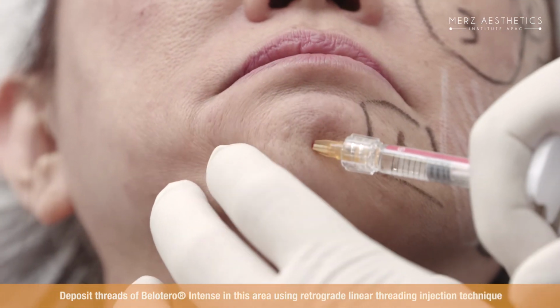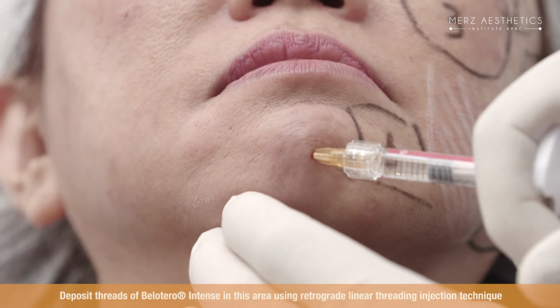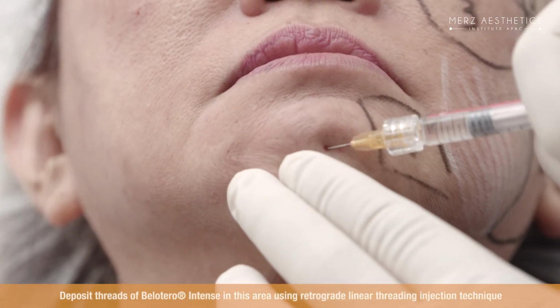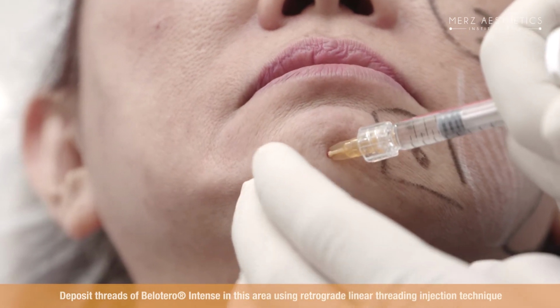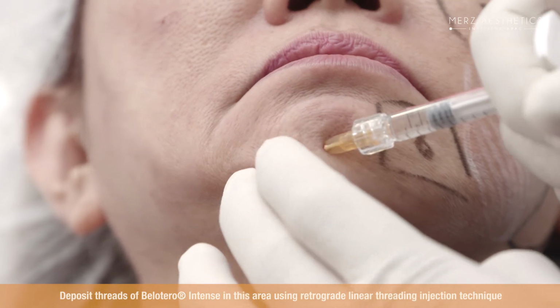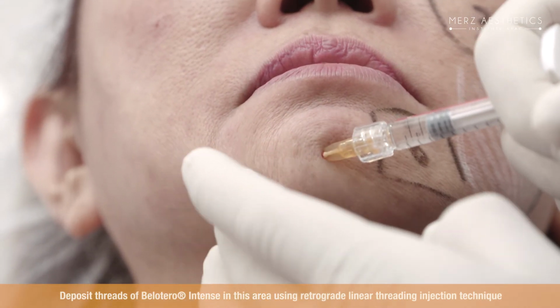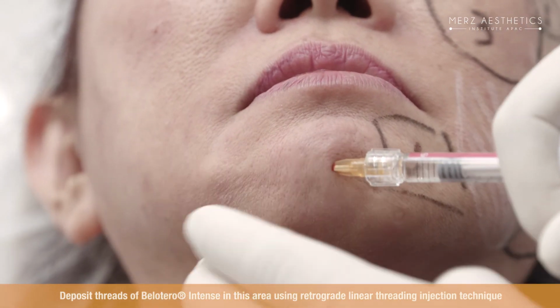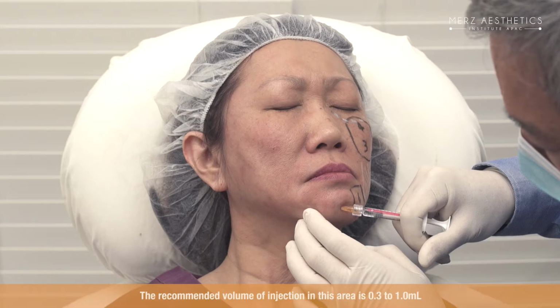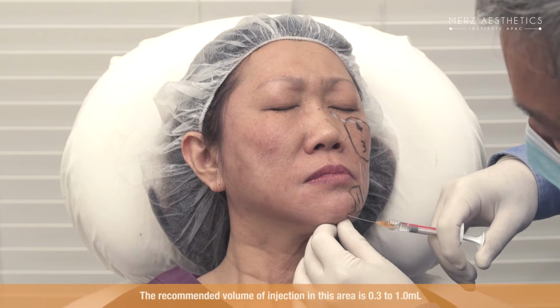The primary intention over this injection area is not so much to project or lengthen the chin, but to suspend the jowl better. This injection area is optional and recommended for those with more severe jowling. The recommended volume of injection in this area is 0.3 to 1 milliliter.